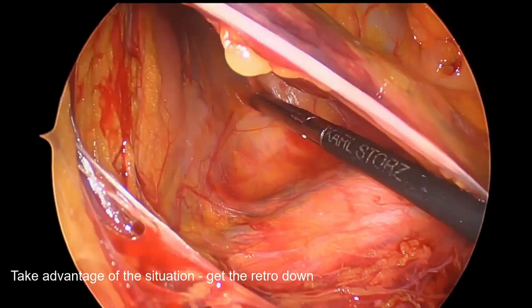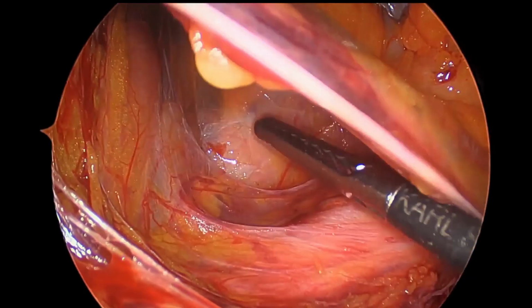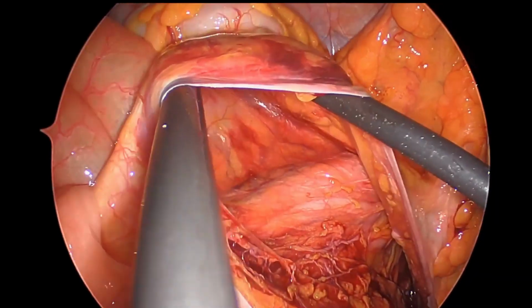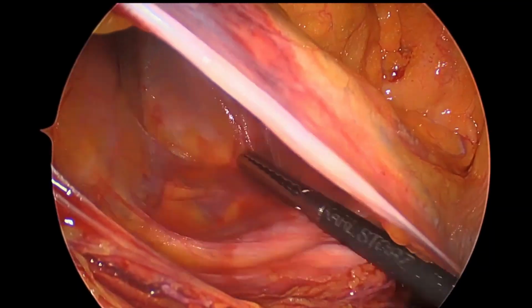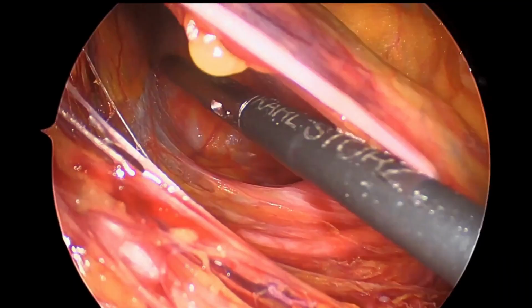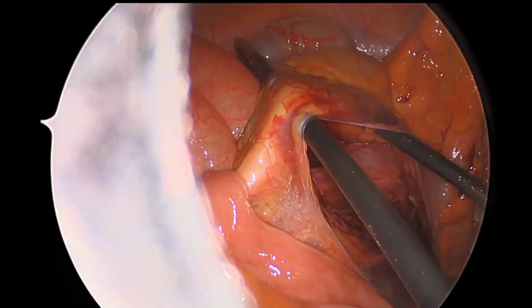So take advantage of the situation. As much of the dissection as you can do from this position will help you to gain length when doing your anastomosis. A lot of people think of the length being gained by dissecting the lateral attachments of the colon, but it's really actually separating all the retroperitoneal structures off of the mesocolon where you get your maximal length, and of course also taking the IMA pedicle high and taking the IMV as well.